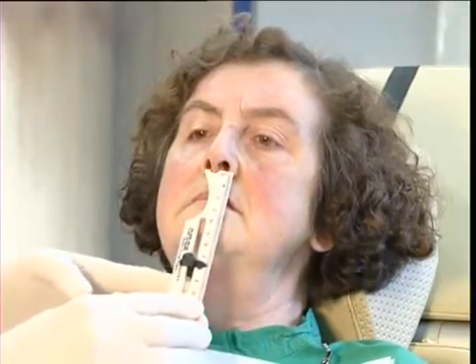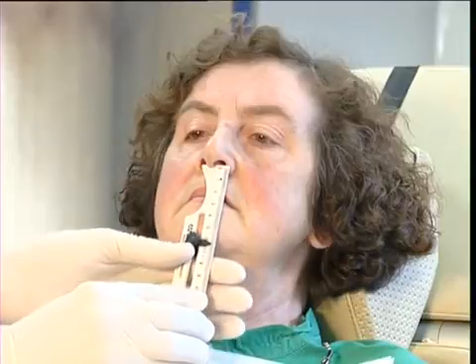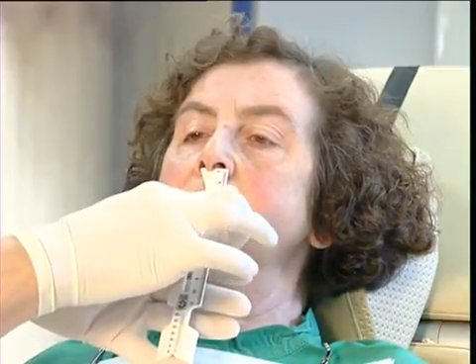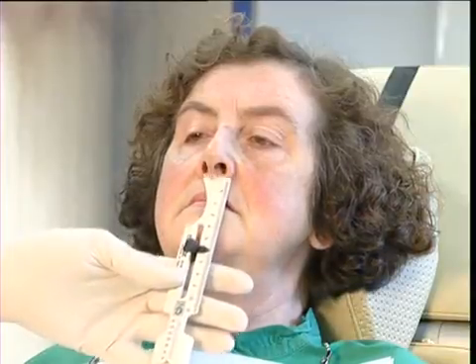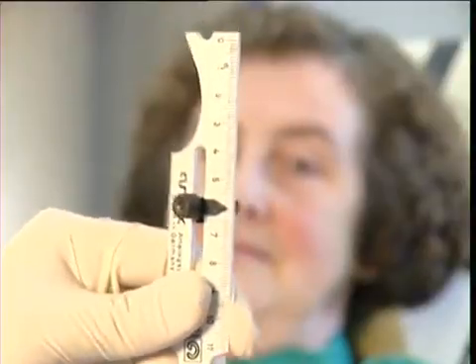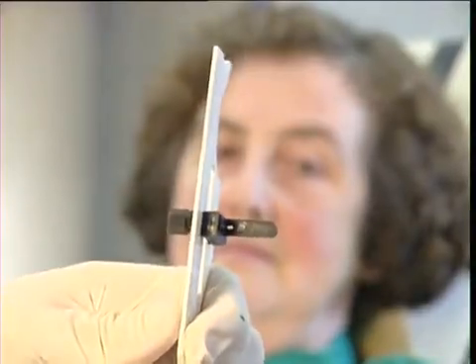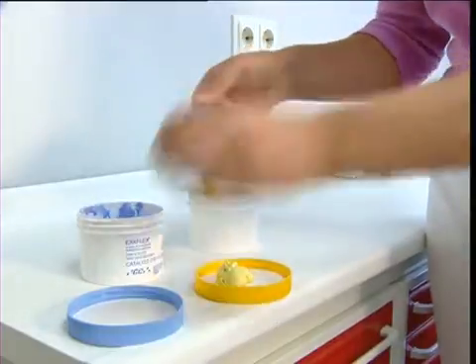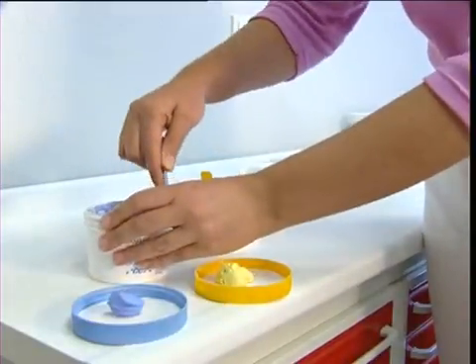There is another physiological method which makes use of the width of the hand between the index and the little fingers. This dimension can also be measured with the Artex meter. The groove is placed beneath the nose and the stop pushed under the chin. The value is then determined and entered onto the patient's record for evaluating at a later date. The assistant needs 2 silicone putty bite blocks for taking a preliminary bite registration.